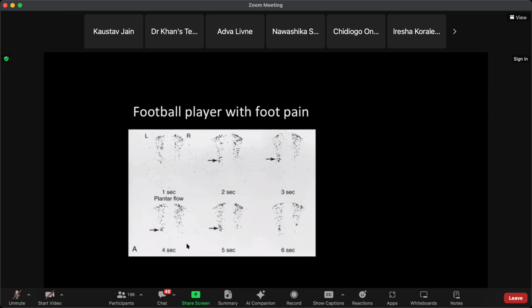Yeah. So I think this represents potentially a triple phase scan. The first set is going to be looking at whether there's hyperemia in the area, of which at 5 seconds there's already an arrow very kindly put in the area where there is increased foci of intensity, which would indicate hyperemia.